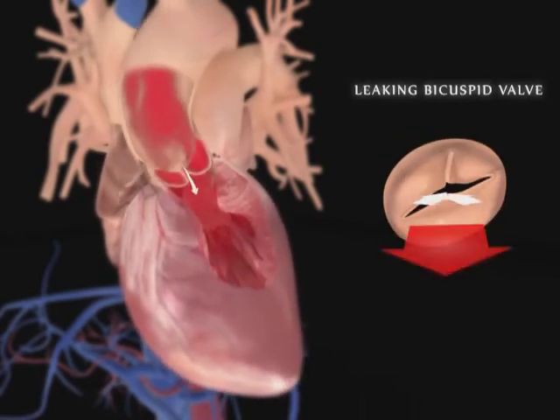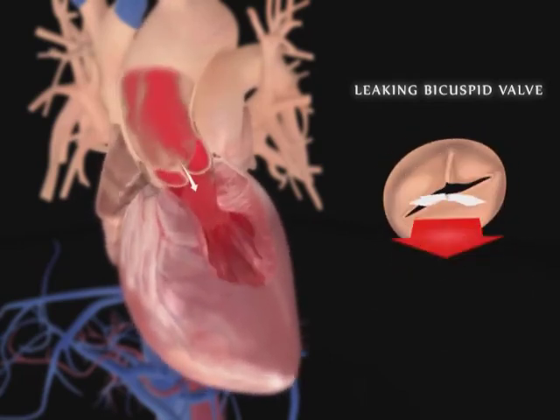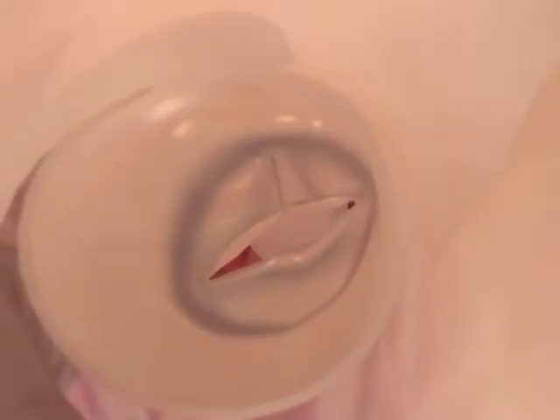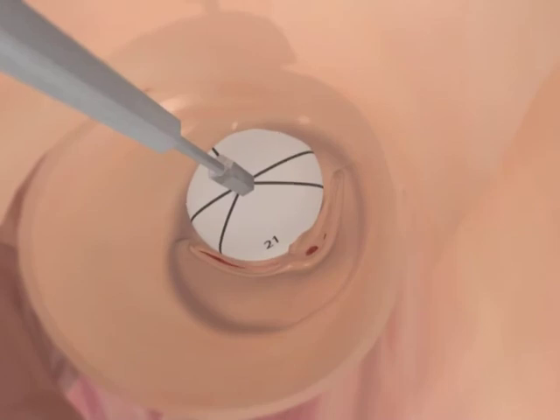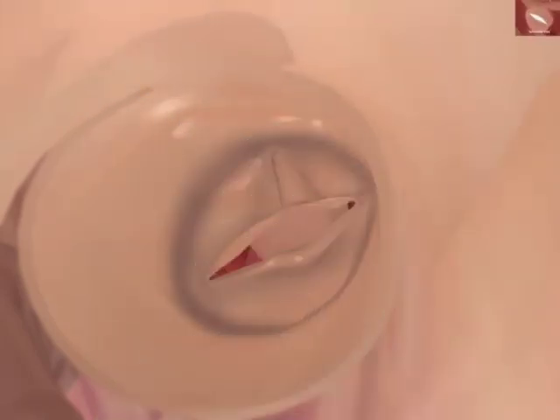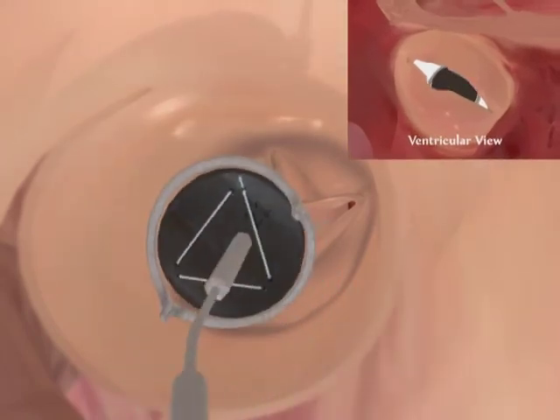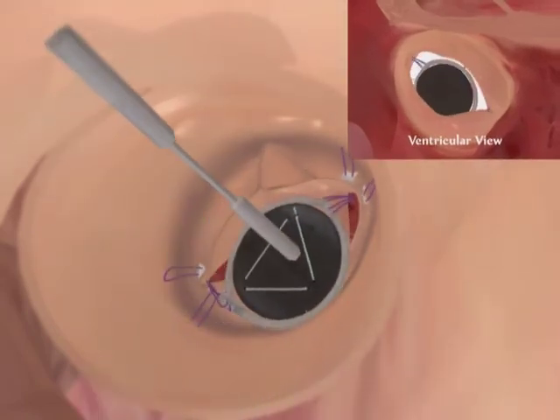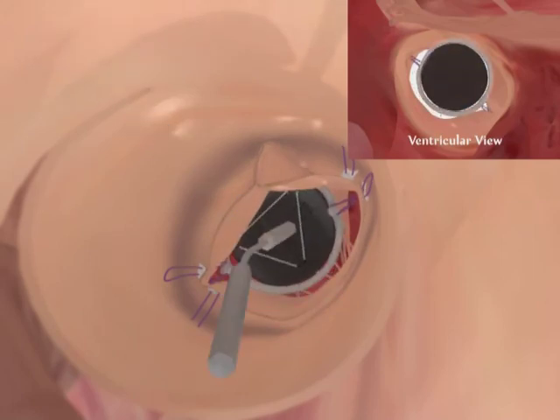In addition, a HAART 200 bicuspid ring has been developed for patients with congenital bicuspid valves, or valves where 2 of the 3 leaflets have fused, and the valves demonstrate AI. A sizer designed specifically for use in bicuspid patients measures the leaflet free edge length of the larger leaflet or the 2 fused leaflets. The appropriately sized HAART 200 ring is implanted in the same procedure as described for the HAART 300 tricuspid device.